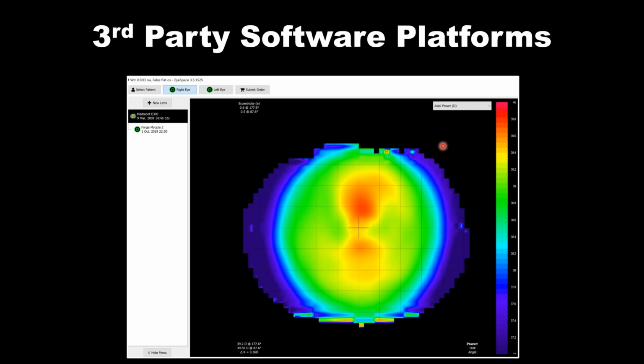So once you've rendered that topography, now we can begin the process of building a rigid contact lens from the software. This EyeSpace is a completely independent third-party software, meaning that it's a platform that runs on its own, and you will import various topographies.